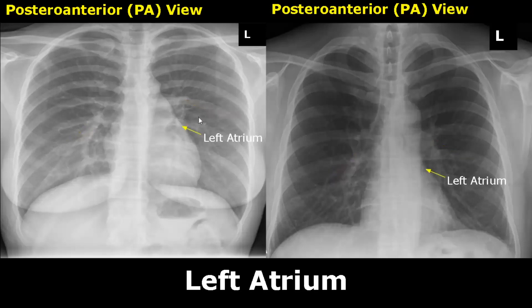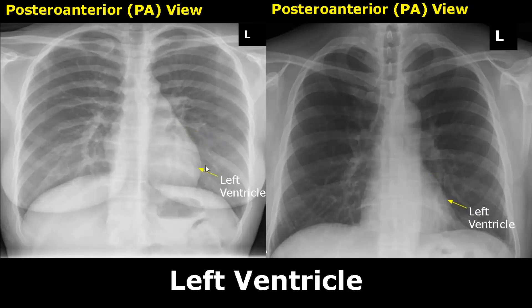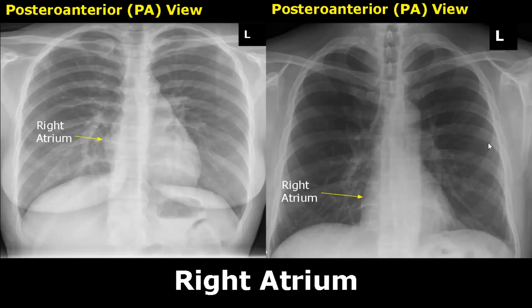Moving on to heart chambers, starting with the left atrium. This is the location of the left atrium; it forms a part of the left heart border. Below the left atrium will be the left ventricle. The left heart border is formed by the left atrial appendage and the left ventricle. This little bulging structure is the right atrium, which forms the right heart border. The right ventricle cannot be distinguished and it is not a part of the right heart border on x-ray.